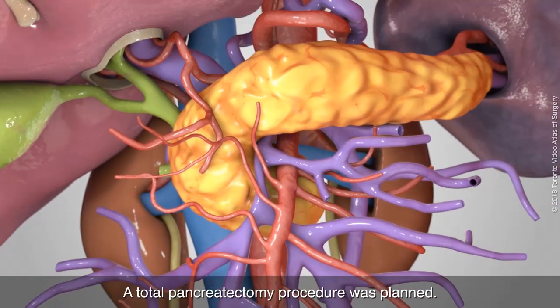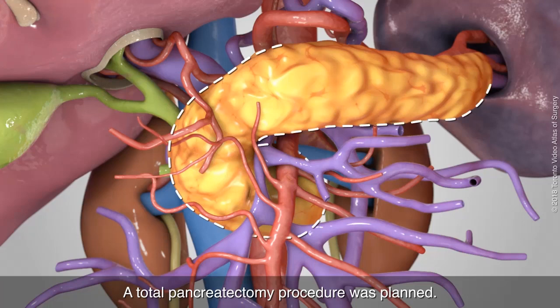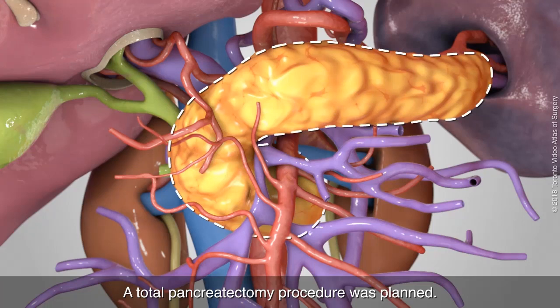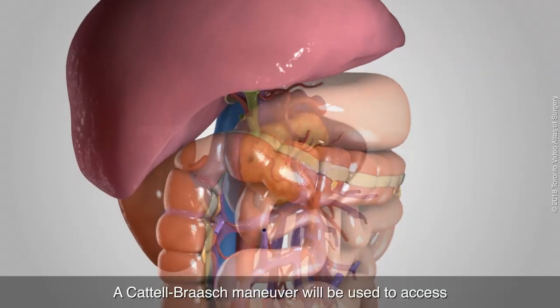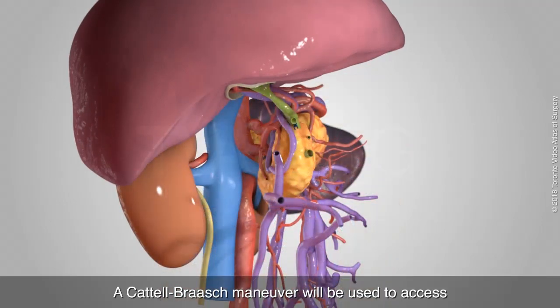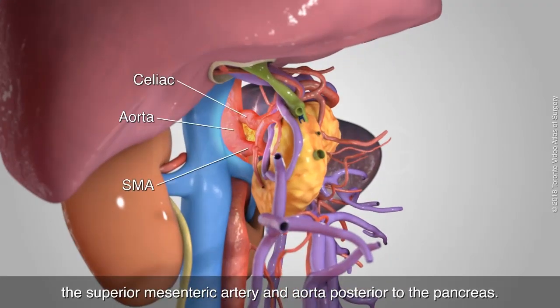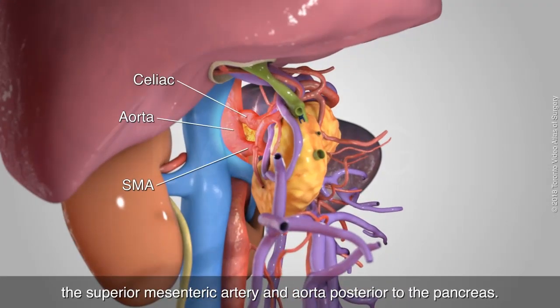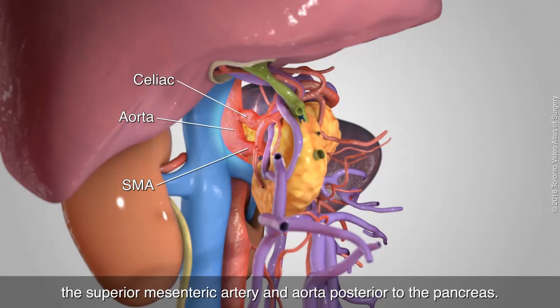A total pancreatectomy procedure was planned. A Cattell-Braasch maneuver will be used to access the superior mesenteric artery and aorta posterior to the pancreas.